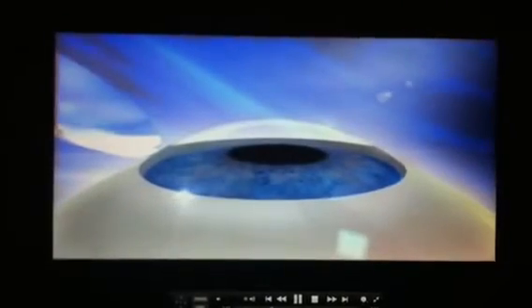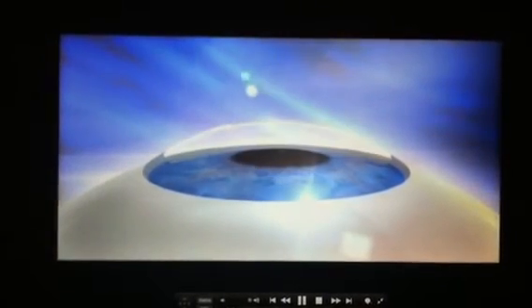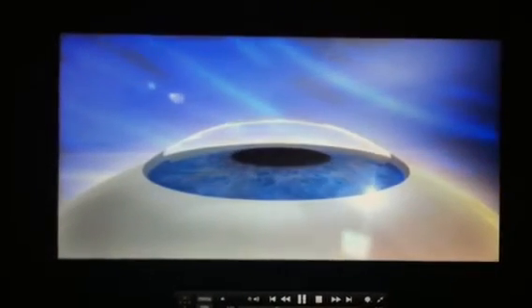After the laser, which typically takes only 15 to 60 seconds, the corneal flap is simply replaced. Because corneal tissues have extraordinary bonding qualities, no stitches are needed.